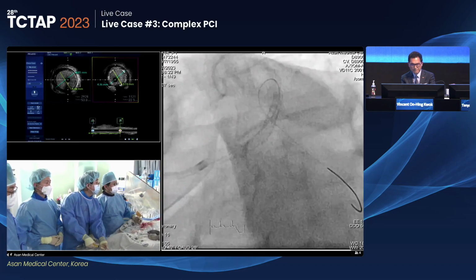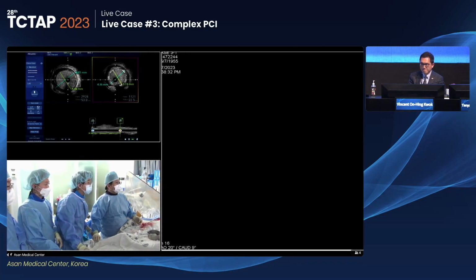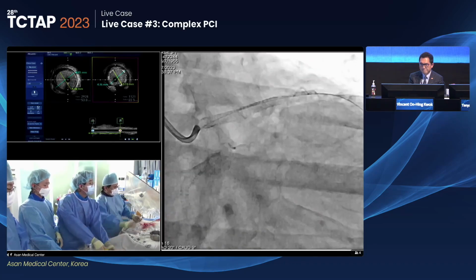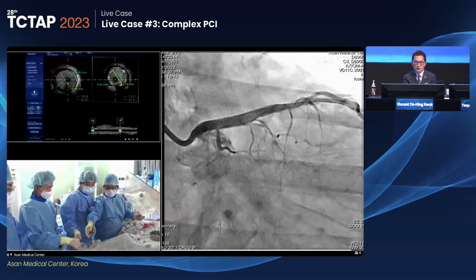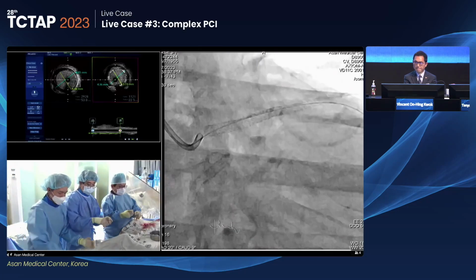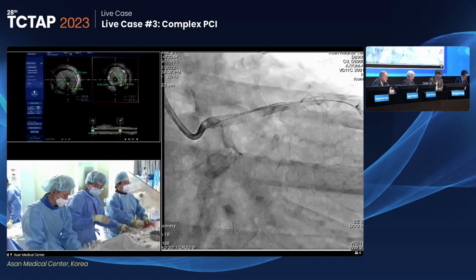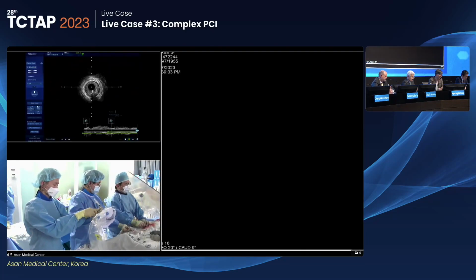Yeah, I agree, especially if the circumflex was a really valuable artery here, you might take that strategy to avoid stenting across. Yes. Circumflex flow is getting better than before. In addition, I mentioned before that there is just collateral flow from the RCA to the distal circumflex, so I don't care about the circumflex. So just focus on the left main to LAD crossover without jailing the side branch wire.